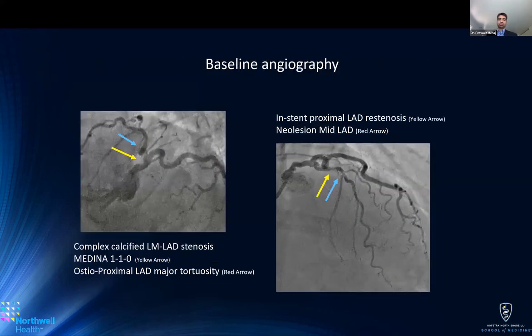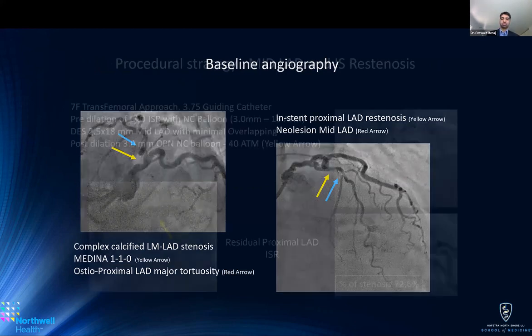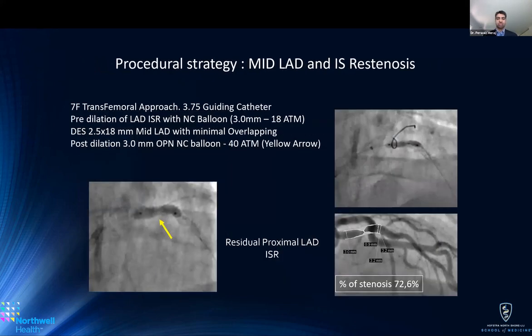This is a case example, as I'll show you here, of a left main and LAD. The left main is de novo calcium, and the LAD is actually in-stent restenosis with calcium behind the stent. So in the same patient, you can see here what was done is that a balloon was used, sized appropriately for the left main. Lithotripsy was performed, and then the decision was made about what to do with the LAD. You can see here, after high pressure balloon inflations, there was still a waist, what we'd call a dog bone waist. The residual stenosis after traditional balloon angioplasty just wasn't appropriate.